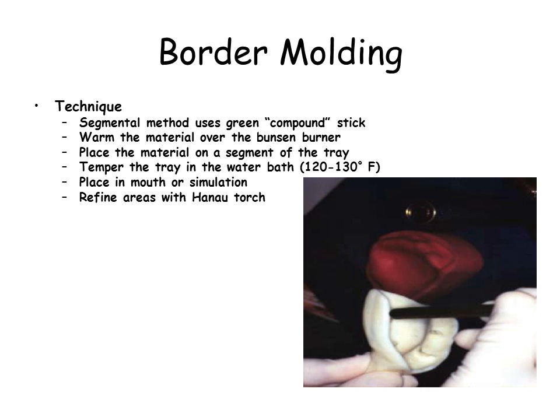The border molding is essentially a vehicle by which impression material is delivered to the appropriate area. The actual registration of functional tissue is with the impression material.